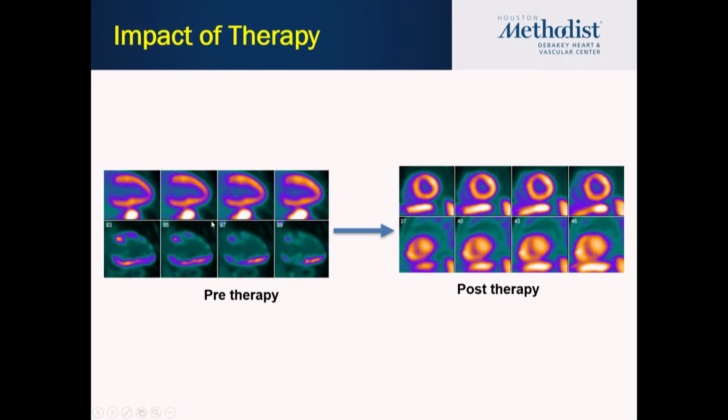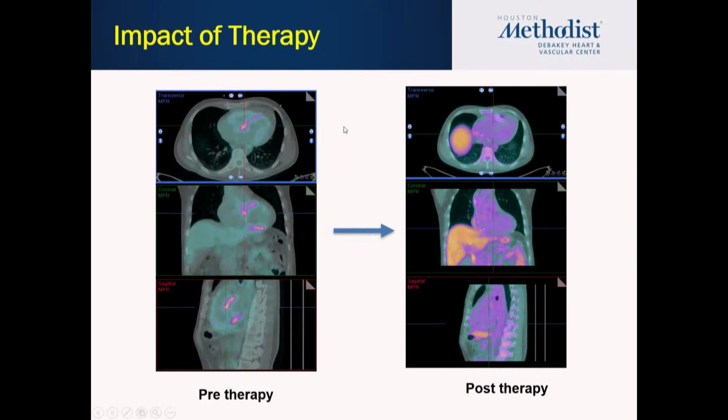This is black and white, and this is colored, and you can see here 3 months of therapy, and the patient had normal uptake. I would say 3 to 6 months has been our average. Sometimes it may not completely go away by 3 months. And you can see here in different views also the uptake in the septum is almost gone to nil, and there is no uptake.